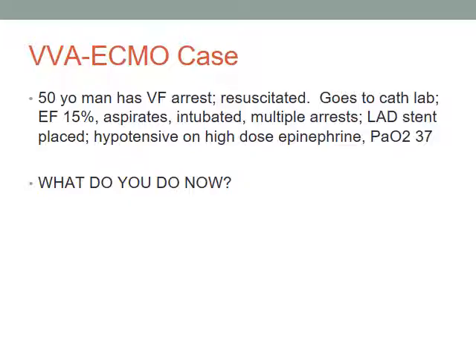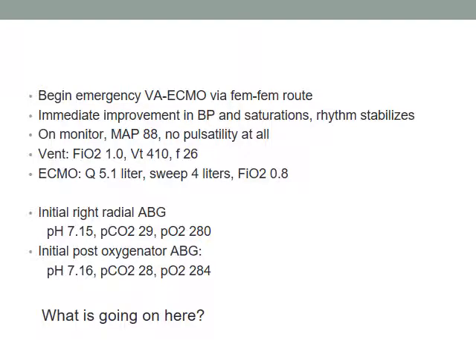Only have until 9:30. What do you want to do? Okay, we'll put him on VA ECMO. I think that's a good idea. He's young. He's got coronary disease. Good chance of having some sort of exit strategy. We don't know for sure that he does, but it's reasonable. He's failing high-dose epinephrine. We can't keep him saturated. He's aspirated. He's going to die if we don't do something. So I think VA ECMO is reasonable.